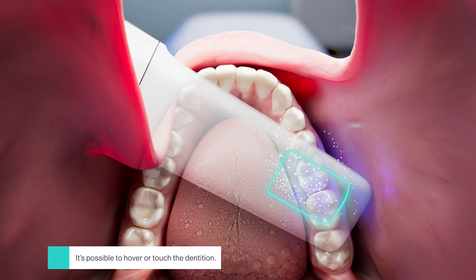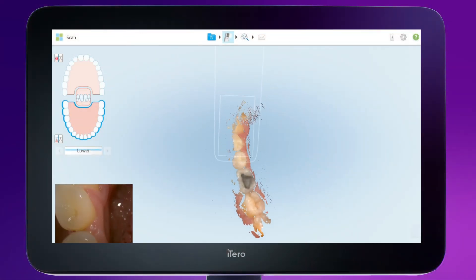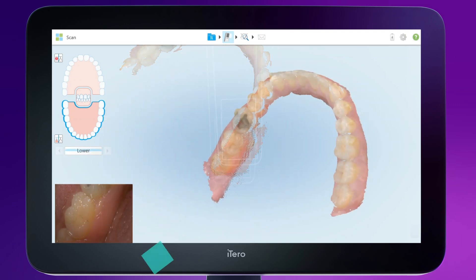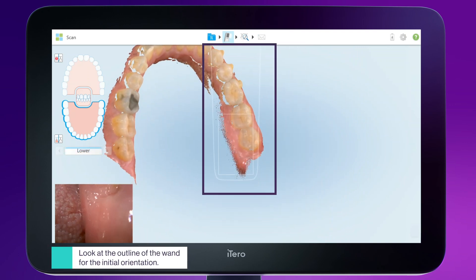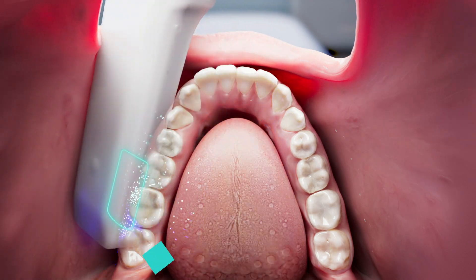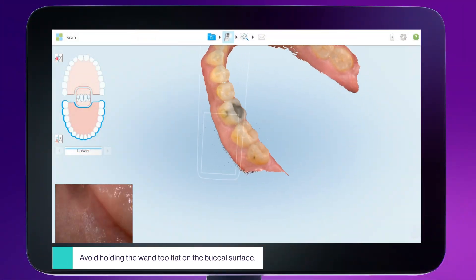It's possible to touch the teeth if the patient finds it difficult to open their mouth too wide, or to use the intraoral camera to get a closer look at an area of interest. Make sure to scan the incisal edges. Hover over the dentition to capture both buccal and lingual anatomy. When scanning, look at the outline of the wand versus the viewfinder — the real-time outline shows the wand's angle. Then roll lingual to fill in any missing anatomy. Hold the wand slightly buccally to fill in missing anatomy without causing discomfort to the patient.